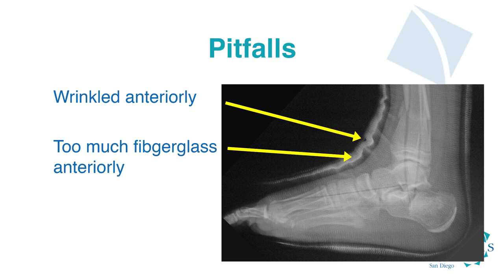You can also see here that this is a Tillaux-type fracture, which means that having the foot in a plantigrade position is not actually optimal, so this should not be a weight-bearing cast. This patient needed a non-weight-bearing cast with the foot in slight plantarflexion to account for this fracture type. For an appropriate patient who does not need a plantarflexed position, the foot should be neutral to the floor.